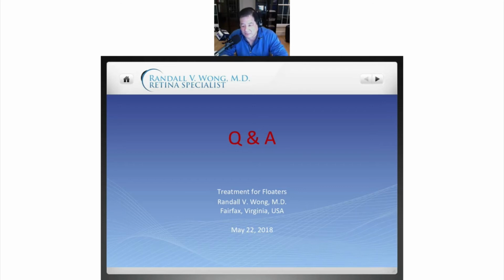How is it that a small vitreal degeneration can cause annoying floaters without any chance of improvement, and the debris apparently left in the eye post FOV would instead be absorbed and eventually disappear? I'm not quite sure what you're concerned about, but it sounds as though in some of the videos you're watching, at the end of the operation there's still stuff floating around. It's our experience that almost everything is gone, whether it's blood, Kenalog, or the initial floaters.